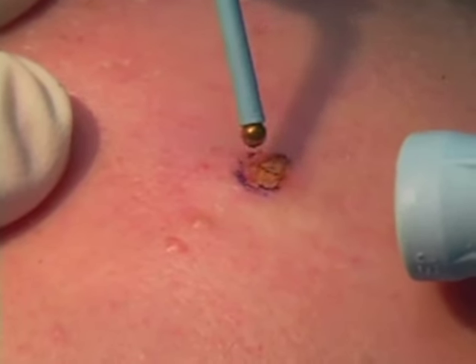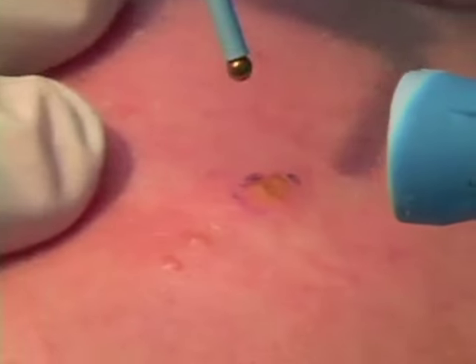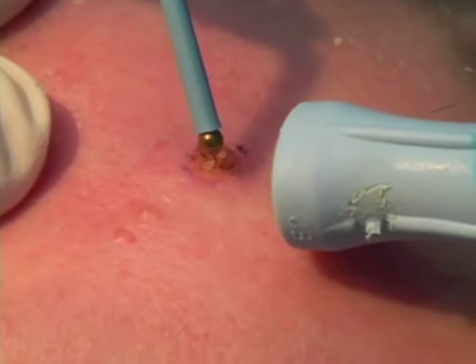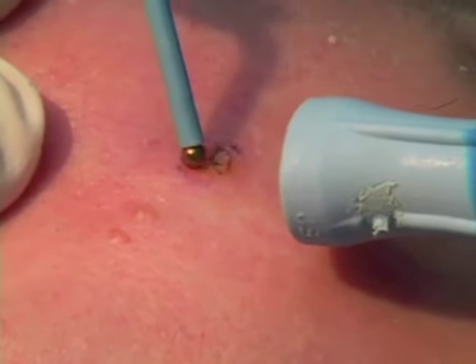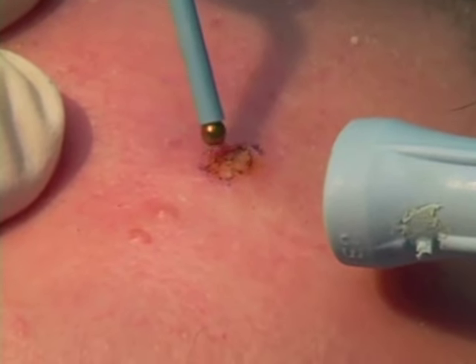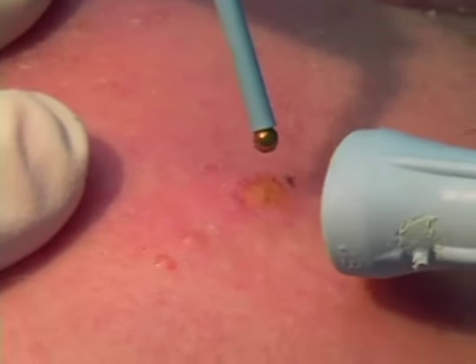And with the ball, you're sort of just making little dimples and then wiping them away. Personally, I think you have better thermal control with the smaller electrode, like the 133, but this works quite well. You just have to not leave it contacting the tissue because you have more surface area.